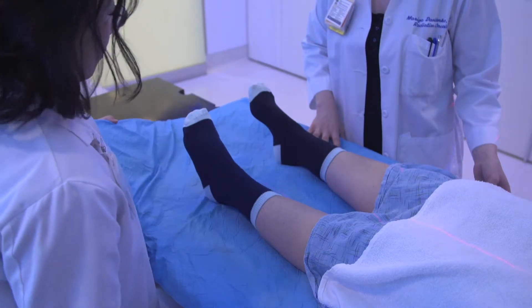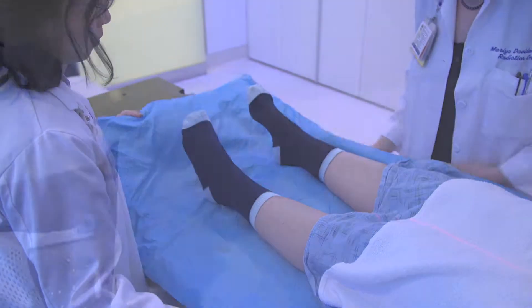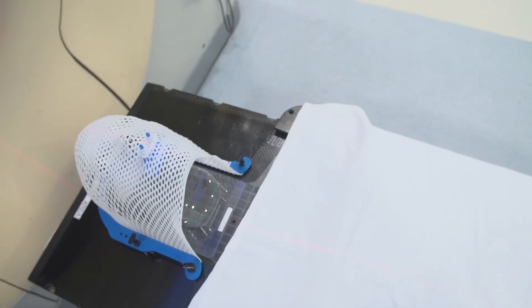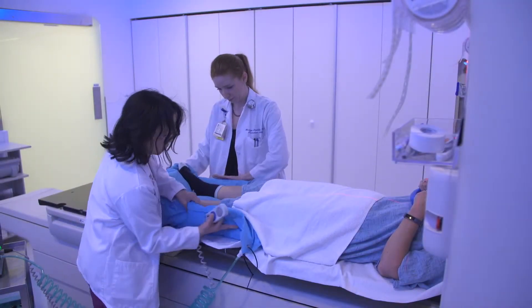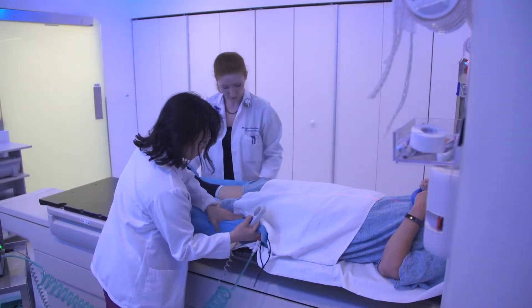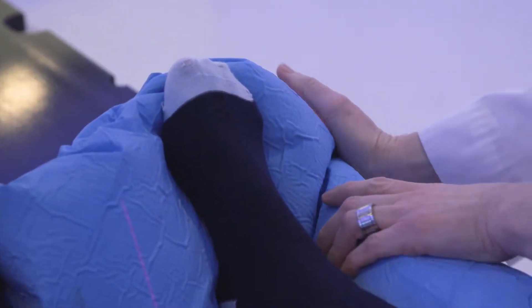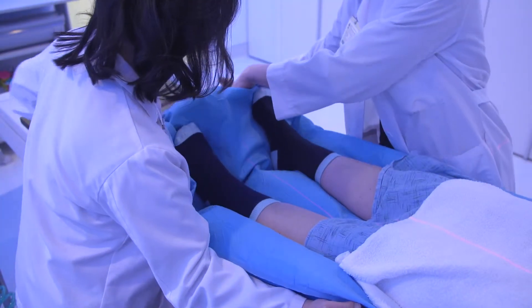A customized device may even be created for you. Common devices include a thermoplastic mask for your head or a cradle for your body. This will provide comfort and ensure that you achieve the best and safest results.